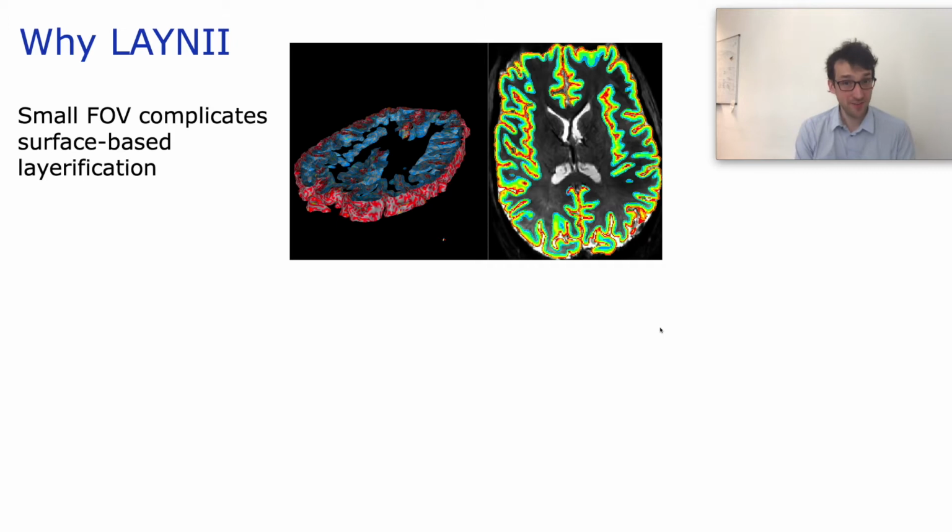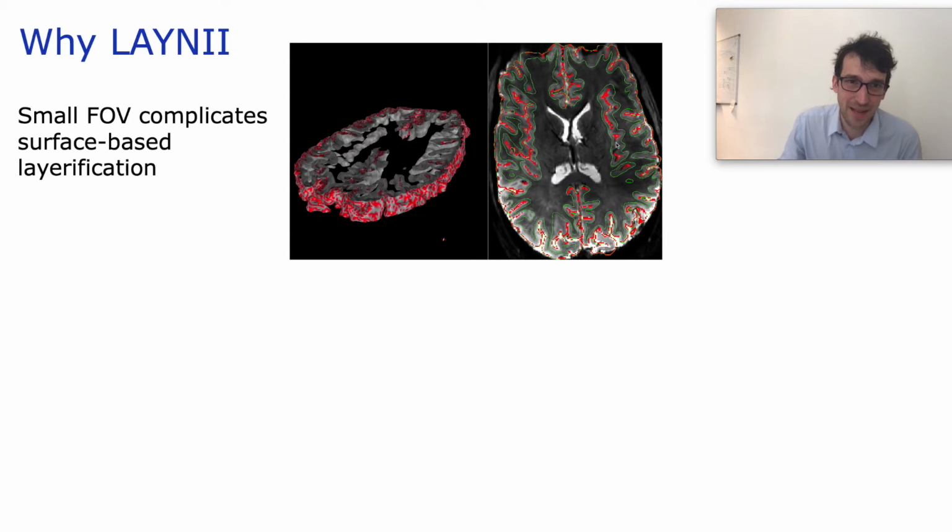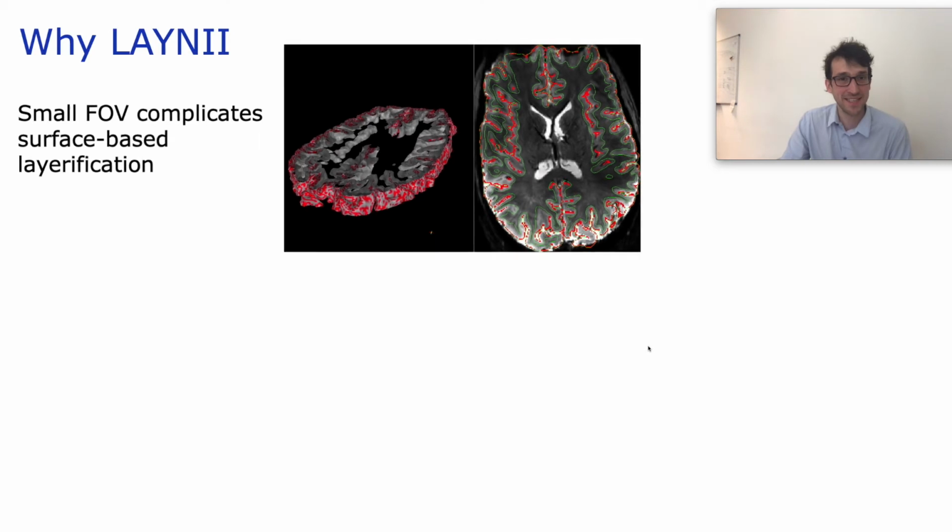The reason why we've developed LayNii is coming from the challenge in layer-dependent fMRI that we have very high quality requirements for the analysis, still while working with these messy, non-standardized data. So for example, the high resolution in layer-dependent fMRI is often only achievable within acceptable speed by using these small field of views that do not fulfill the common topology requirements of mesh-based layerings, namely having closed surfaces without holes. And without these requirements, smooth surfaces are usually not well defined and we end up with unconnected spots as seen here. So we need tools that allow us to work with such messy data.